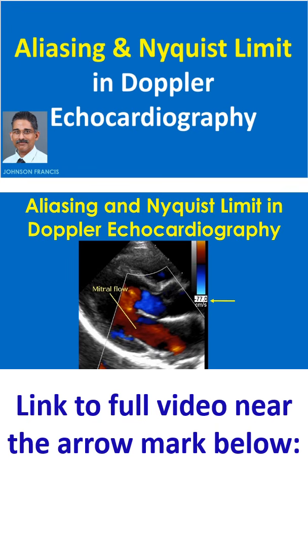Similar phenomenon can be seen in color Doppler echocardiography as well. When the Nyquist limit is exceeded, a flow which should have been depicted as blue, that is away from the transducer, is depicted as red, seemingly as towards the transducer. This is the first wraparound.